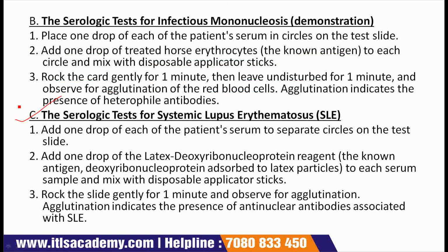Next is the serologic test for systemic lupus erythematosus, or SLE in short. First point, add 1 drop of each of the patient's serum to separate circles on the test slide.